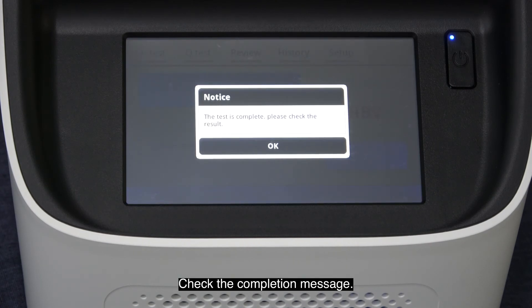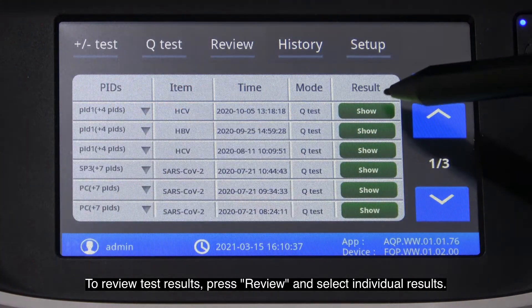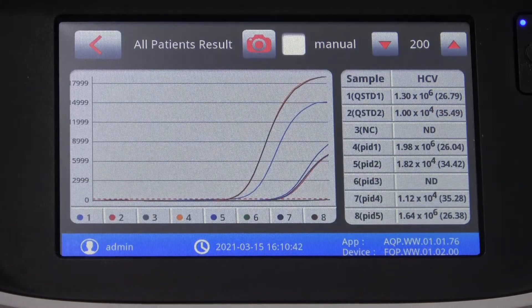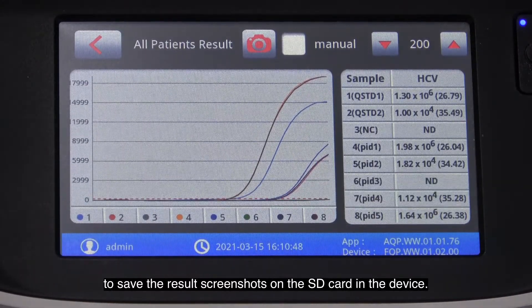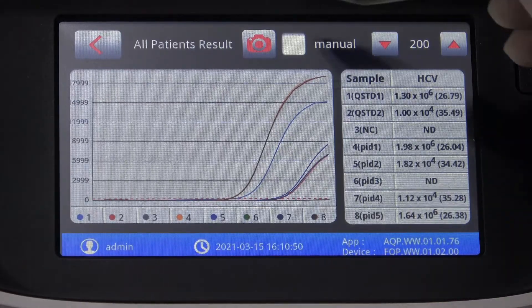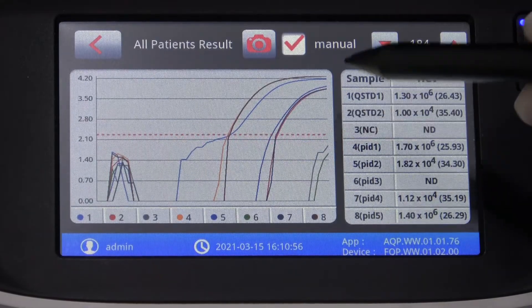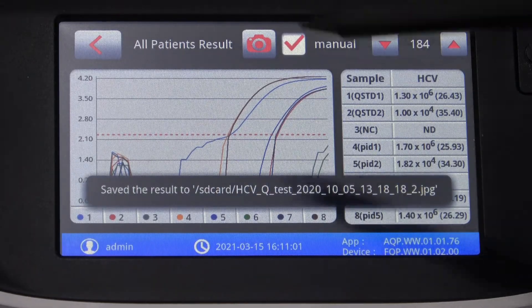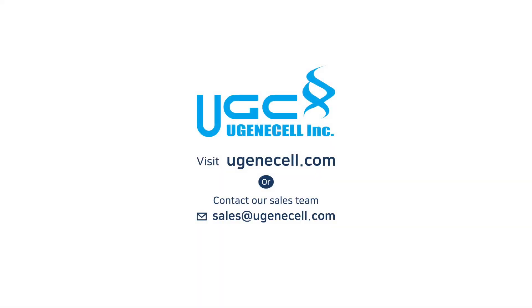Check the completion message. To review test results, press Review and select individual results. Press the camera button at the top of the screen to save the results screenshots on the SD card in the device.